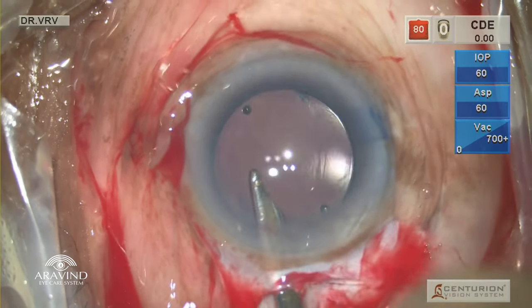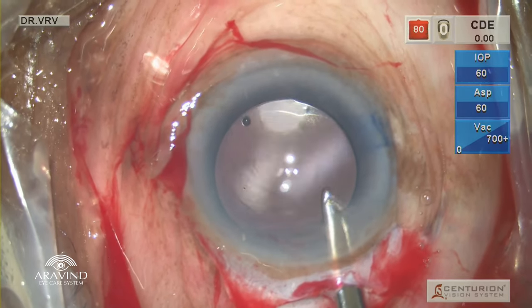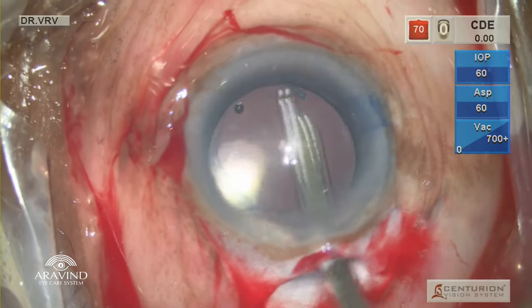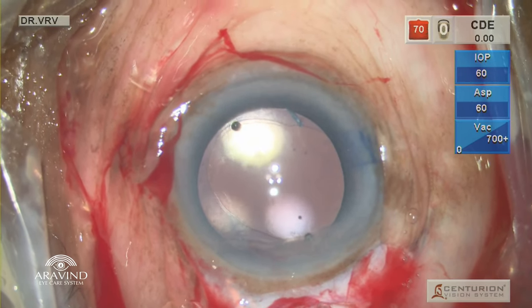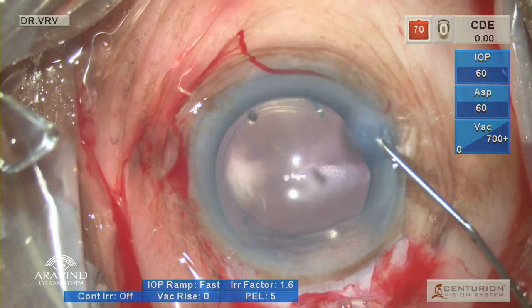First, I depress the tunnel and irrigate all across so as to remove the viscoelastic, and then I start flushing the 5cc of BSS into the anterior chamber. By doing so, the viscoelastic sticking on to the endothelium and everywhere in the anterior chamber and back gets flushed out of the eye. And then using a hydro cannula, BSS is used to hydrate the paracentesis.